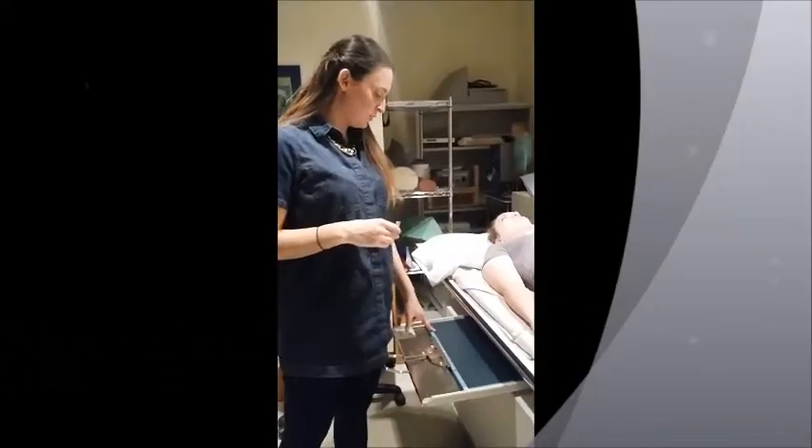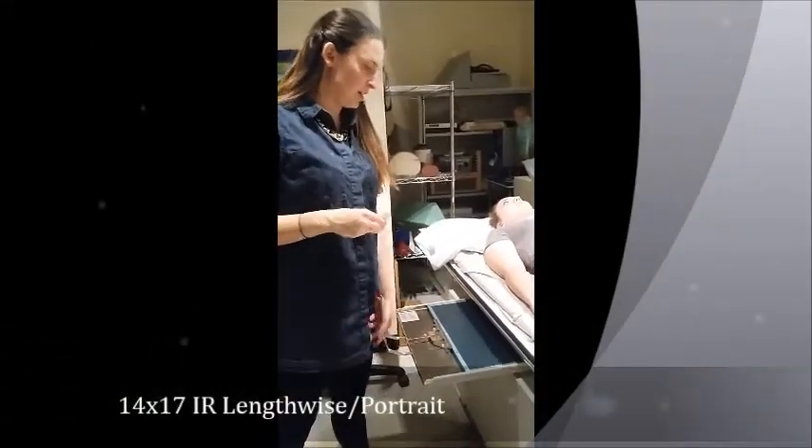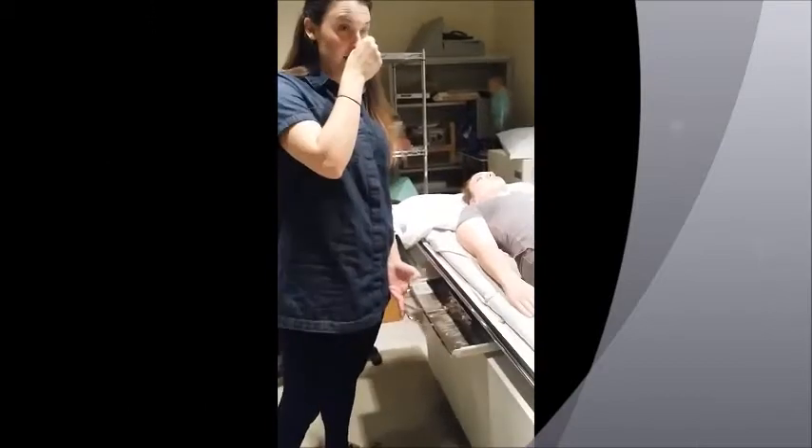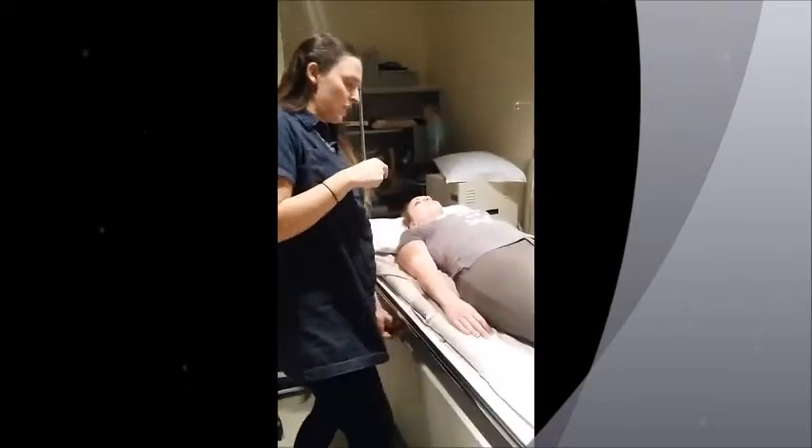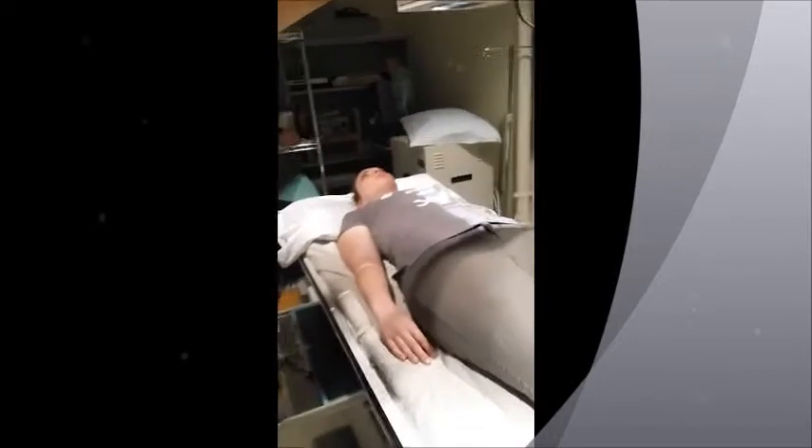For the T-spine, you want to use a 14 by 17 lengthwise. You can have your patient standing or supine, so we're just going to have her laying down. Center your tube with your bucky and you're at 40 inches.